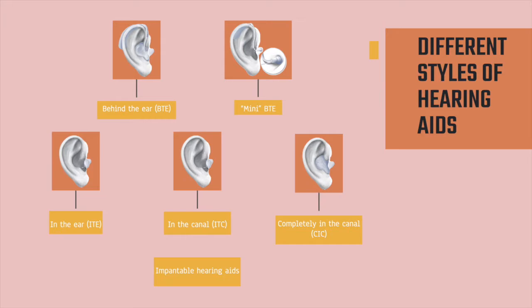For this reason, open-fit hearing aids may be a good choice for people who experience a buildup of earwax, since this type of aid is less likely to be damaged by such substances. In addition, some people may prefer the open-fit hearing aid because their perception of their voice doesn't sound plugged up.